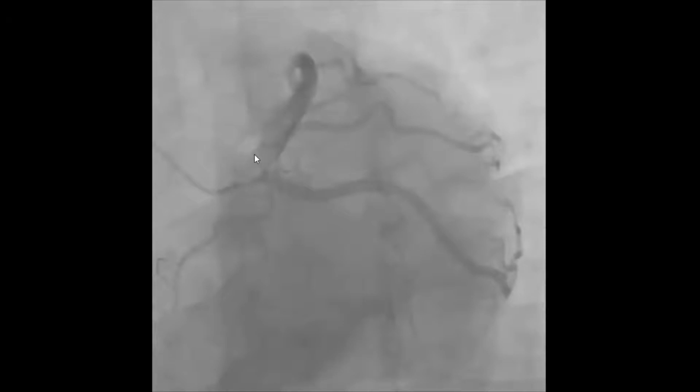So left main stem, the vessel that is on the left side most, this one going this way, all the way, there's nothing left to it. That's the LAD, left anterior descending, in this view. And the vessel that's going on this side, this is the circumflex, the left circumflex coronary artery. Now, why couldn't this be the circumflex? Because this is coming from the LAD, because the left main stem is short, it divides into two vessels, LAD and circumflex, right? So whatever branch that comes off this vessel afterwards, that's an obtuse marginal vessel.